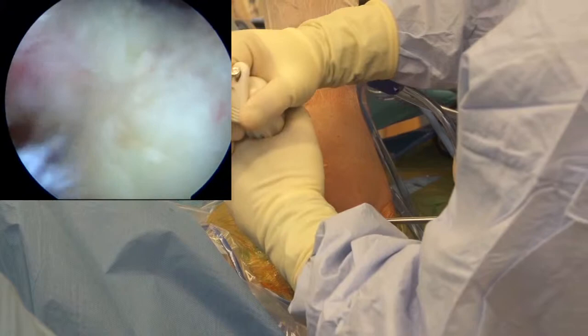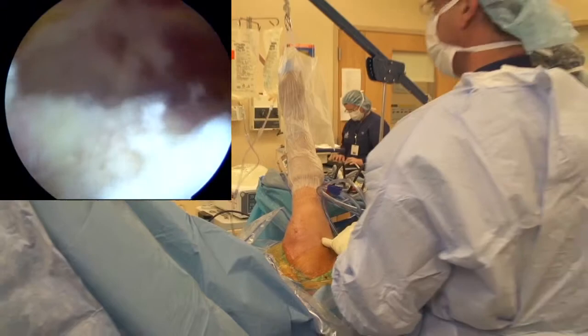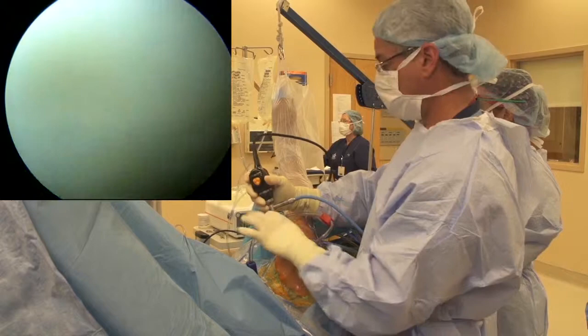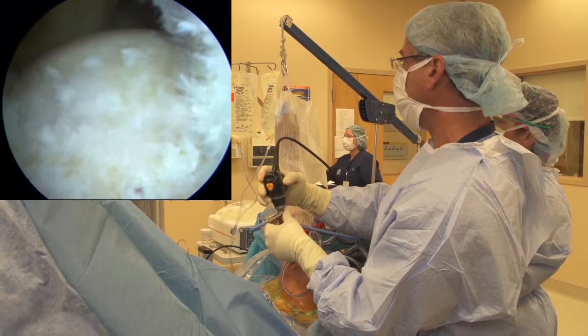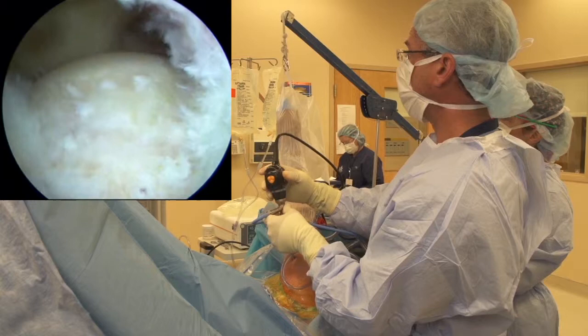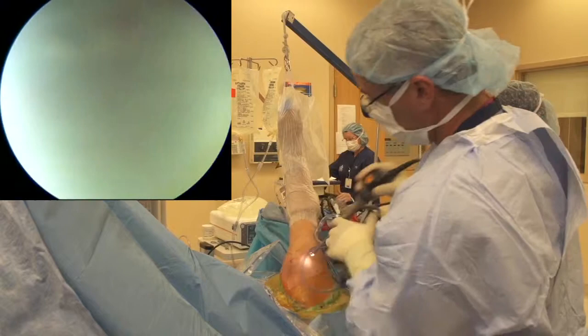You can see we're starting to get some bleeding coming out of the tunnels, which is what we're trying to achieve. So what we'll do now - we like to see that bleeding bed right there. I'm going to come back over from the lateral position and look back down at our bony footprint. As you can see now, we went for about nine holes here in this position. Our footprint is relatively exposed as well. We could potentially add a couple more, but I feel comfortable that we've vented the footprint in an adequate fashion. So at this point I would go ahead and proceed with our actual rotator cuff repair.